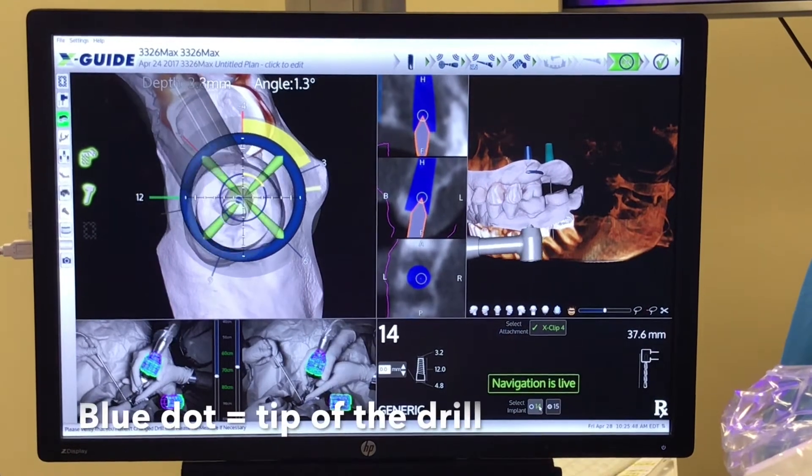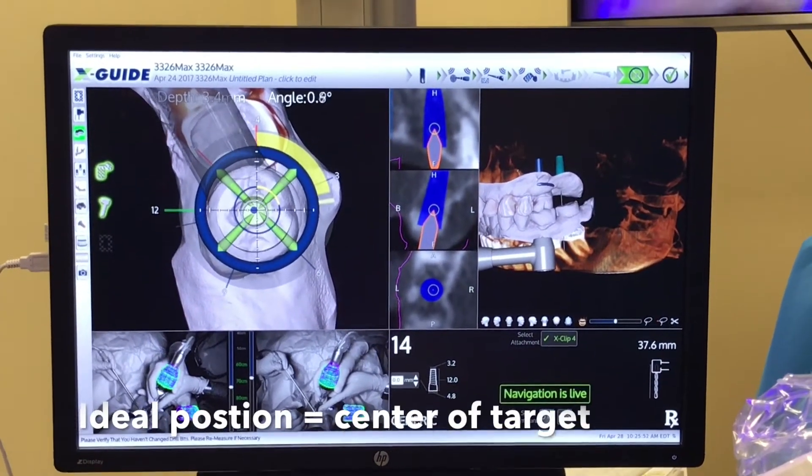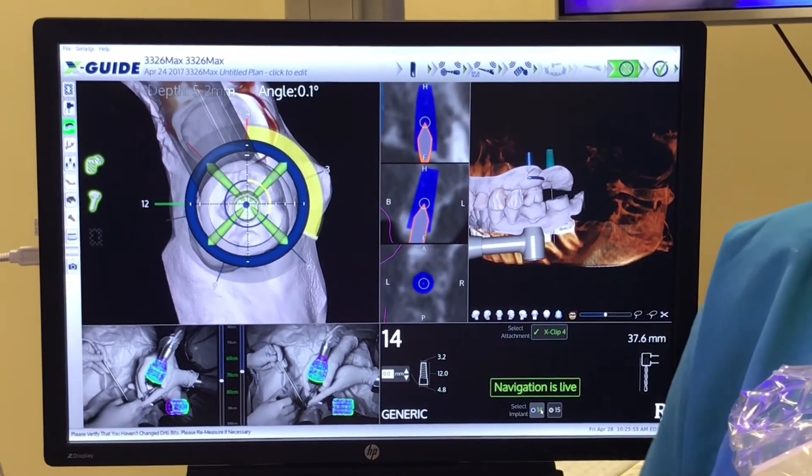We then center the tip of the drill, the blue dot, over the target, which indicates ideal position — the center of the target.